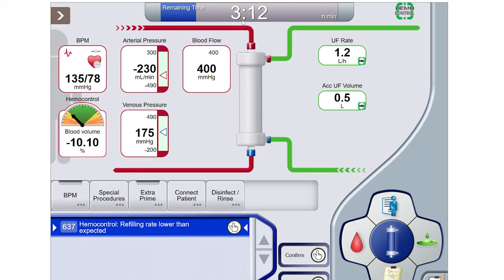All right, so now that we're about 45 minutes into our treatment here, we're actually seeing the blue reminder pop. Our blue reminder will pop if there is a 3-point or greater discrepancy between what we've told the machine to expect for blood volume and what it's forecasting blood volume. Normally blue reminders will pop in the yellow or orange. I think with this one, we're just on the cusp here. And normally I would go in and show you the actual HemoControl setting, the discrepancy between the two, but unfortunately with the simulator we can't.